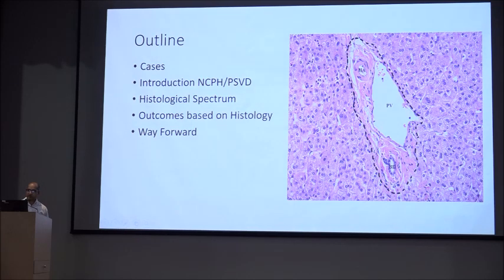This is the normal portal tract, and this dotted black line is the limiting plate. This is the portal stroma, which is silent, not showing any inflammation or myofibroblast activation. There is the hepatic artery, and of similar size there will be a bile duct, and a portal vein, which is larger than these two structures. The sinusoids lie between the liver plates, and they are also not showing any inflammation. This is a normal portal tract and normal liver parenchyma.